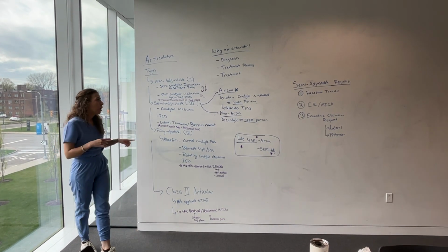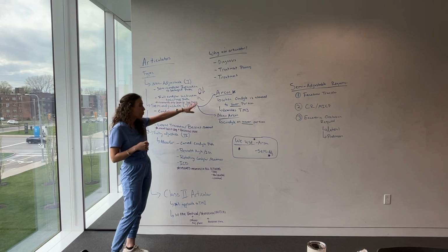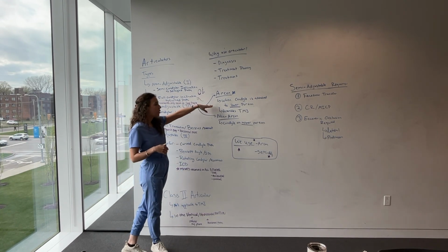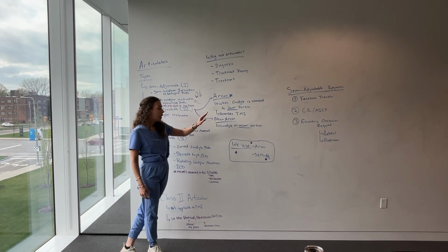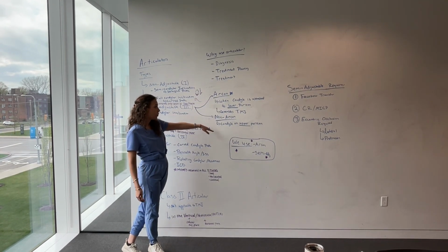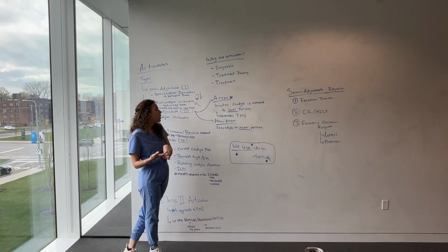So in our case, we're going to be using the Arcon type, which is a type 3, which is when the condyle is attached to the lower portion, and this resembles a TMJ. A non-Arcon type is when the condyle is on the upper portion. So that's the difference between these two. So remember that. Why do we use an articulator?